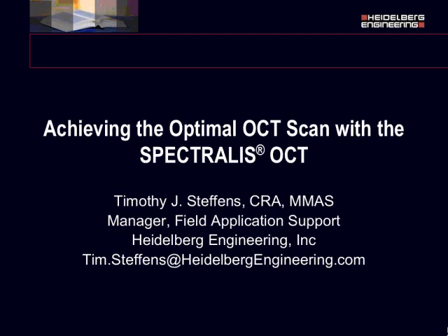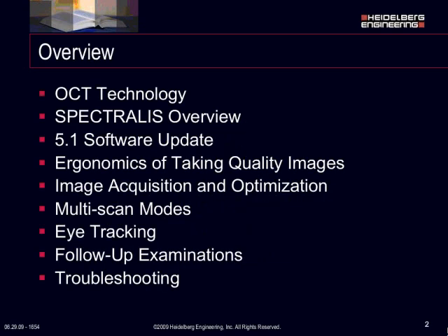Hello, everyone. Just want to welcome you to the session here of achieving the optimal OCT scan on the SPECTRALIS OCT. Just a quick overview again. We're going to be talking a little bit about some OCT technology, a SPECTRALIS overview, some 5.1 software that should be released soon, and then we're going to really get into the meat of the course here, talking about ergonomics of taking images, and image acquisition and optimization itself, and then we'll also go into follow-up scans.